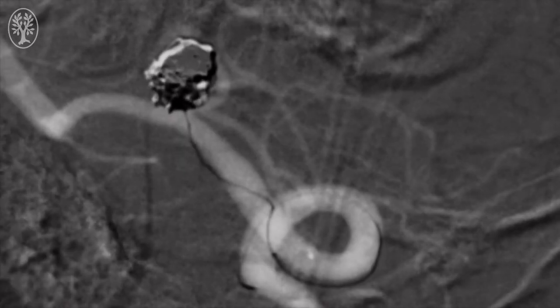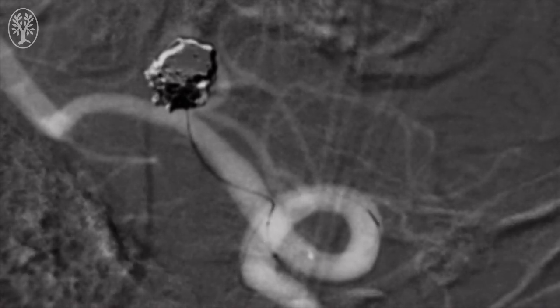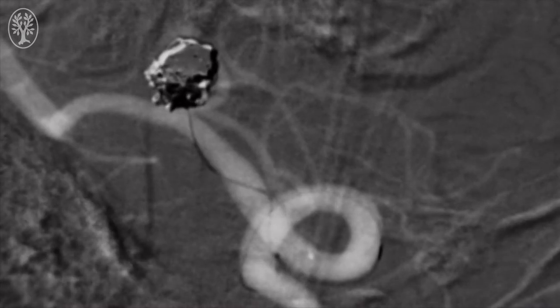Again, you can see from the last angiogram that there's still some patency of the neck, and given the history of rupture in this aneurysm, and now the recurrence of the neck, we want to be very aggressive at trying to coil this residual neck, but again ensuring patency of the posterior inferior cerebellar artery.